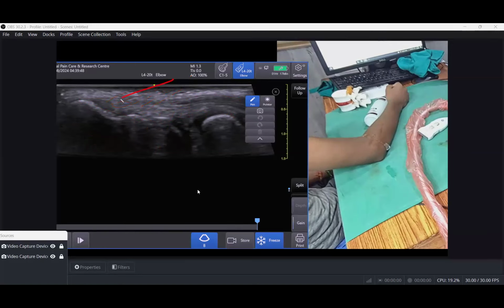If you puncture this tendon multiple times, we are creating an injury, and injury is usually followed by healing. So we are promoting neovascularization here and promoting healing of this tendon. We can also put a needle directly here, in-plane needling, and inject PRP. About 0.5 to 1 ml of PRP can be injected wherever the tear is in case of tennis elbow.